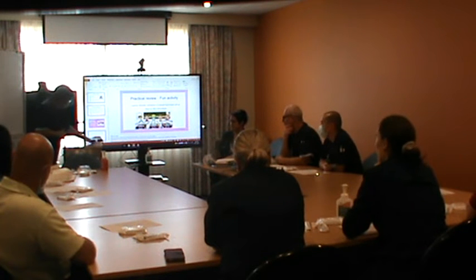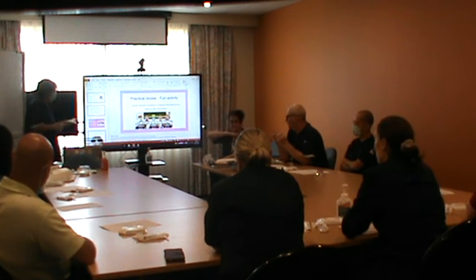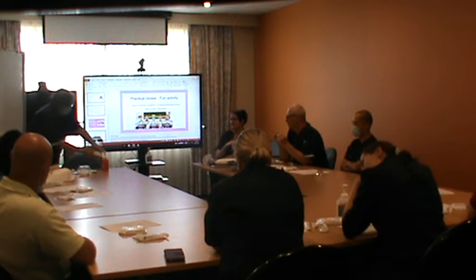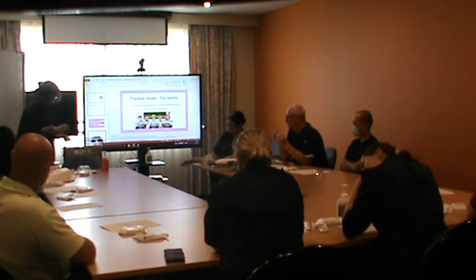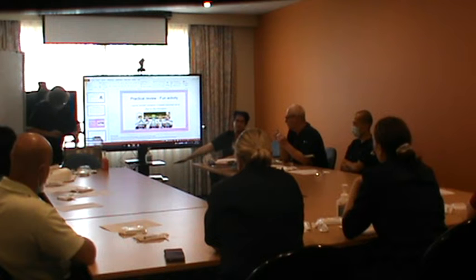Just remember, when you're cleaning the trolley, and it's very important, that all those little bars on the sides have to be sterile as well. So it's not just the top that you're cleaning. It's also good to go down the legs. And if you're going to use the bottom of the trolley to stock any of your things, it should be cleaned as well.